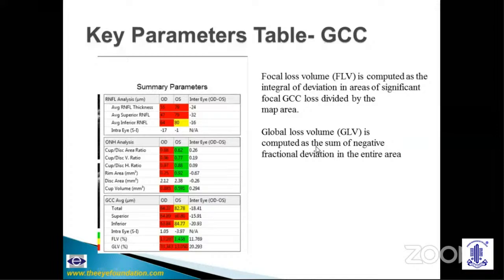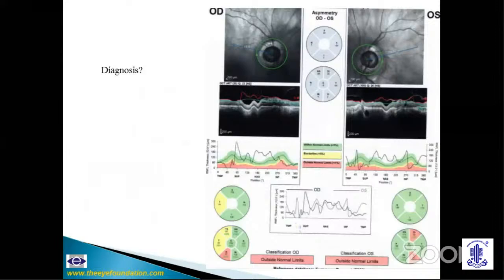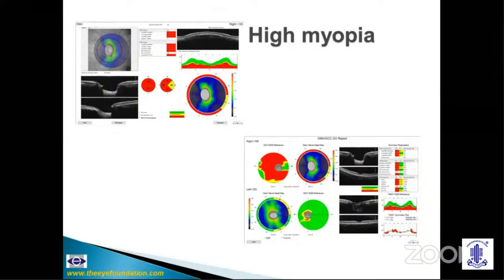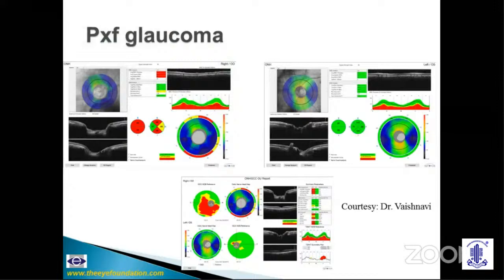In pseudo exfoliation glaucoma, both RNFL and GCC show advanced damage in the affected eye, whereas the fellow eye with pseudo exfoliation but no glaucoma shows parameters in the normal range. In moderate damage glaucoma, you see the TSNIT graph dipping with RNFL thinning and parameters in red. A floor effect occurs when the TSNIT graph is entirely in the red zone in advanced cases. OCT in high myopia has significant limitations: the wall is stretched unevenly, in many regions going beyond the depth of focus of the machine, making it unreliable.